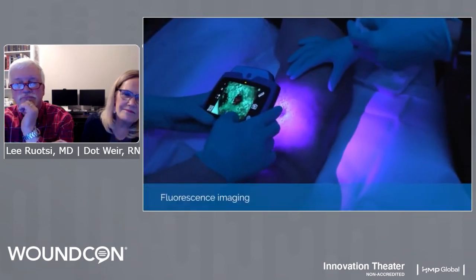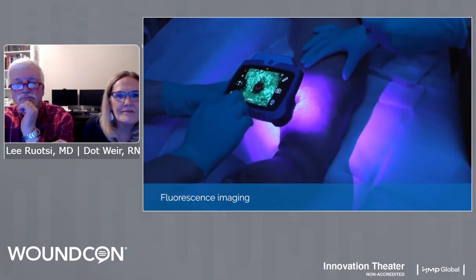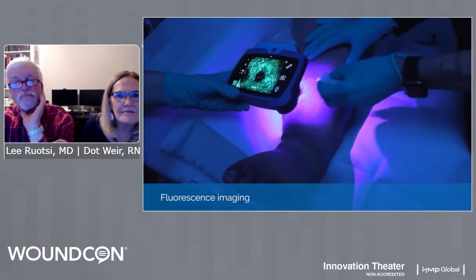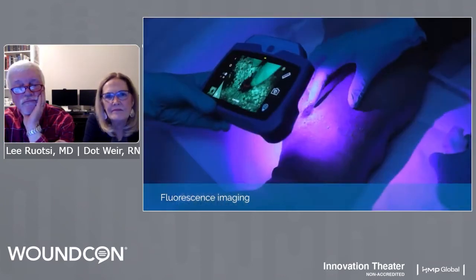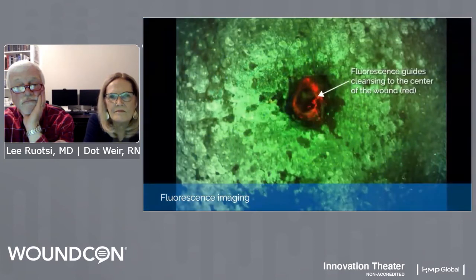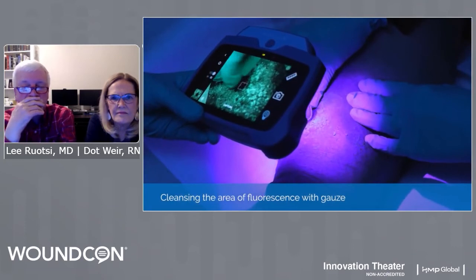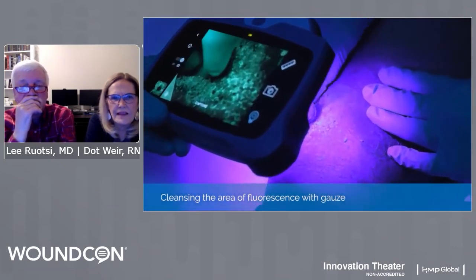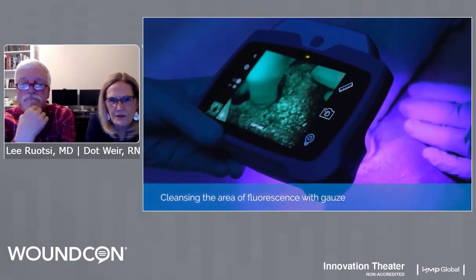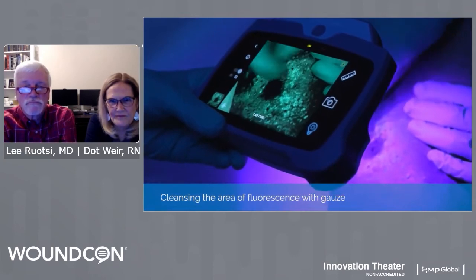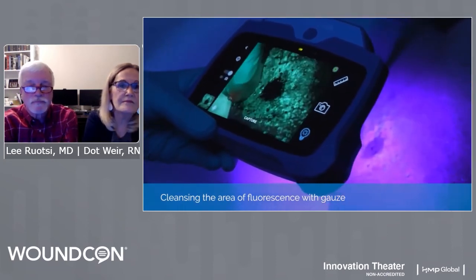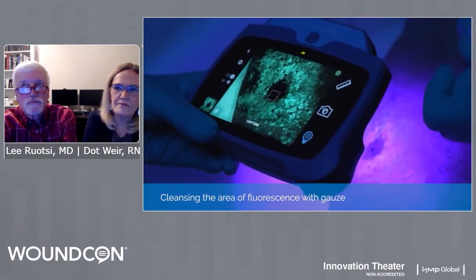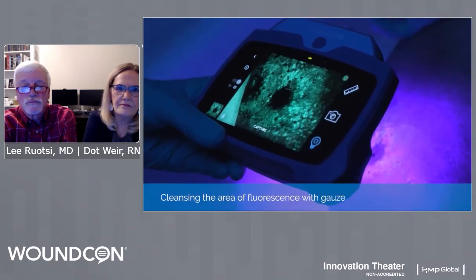There's my point — you can't tell what you're looking at with the naked eye. When we look at dry skin, this is the typical look. And then in the immediate peri-wound area you see the scarlet or blush-colored fluorescence — that indicates bacteria. I'm going to try to wipe it away. Where the wound is dark is actually healthy tissue. I was able to completely obliterate the fluorescence because I knew where it was. You can even see it on the gauze — that's a good reason to move your gauze around frequently. We totally were able to get the rest of that off just by knowing where it was.